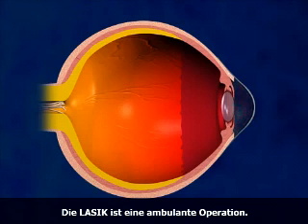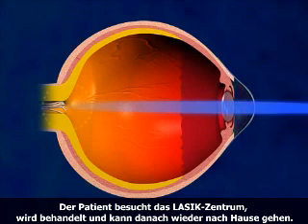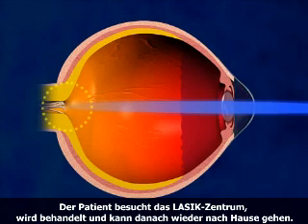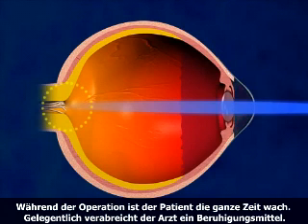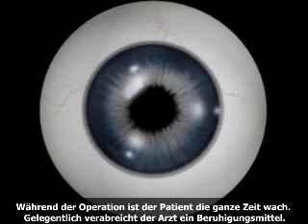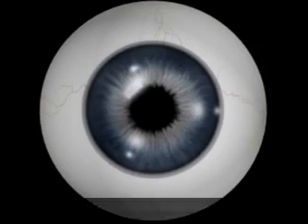LASIK is an ambulatory procedure. The patient can walk into the surgery center, have the procedure, and walk out again, and is awake the whole time. Occasionally, the doctor may administer a mild oral sedative.